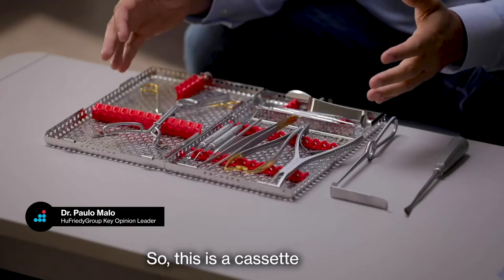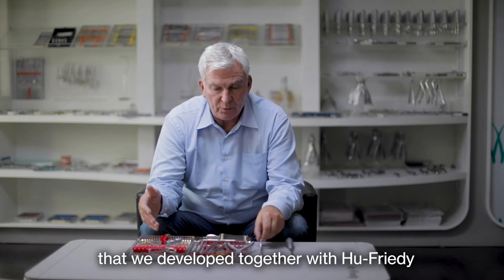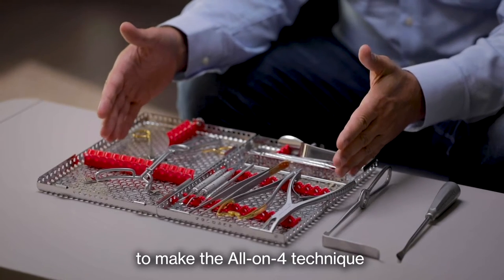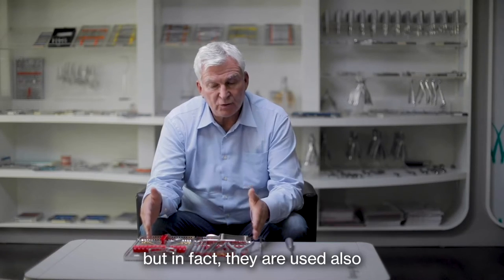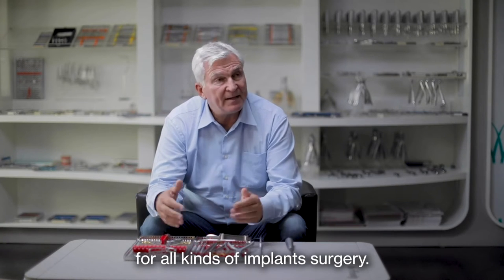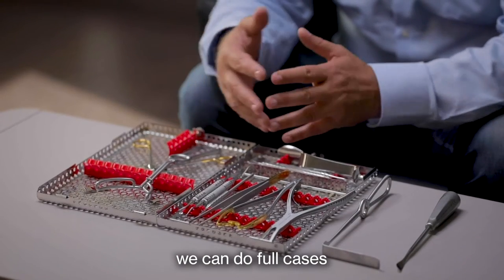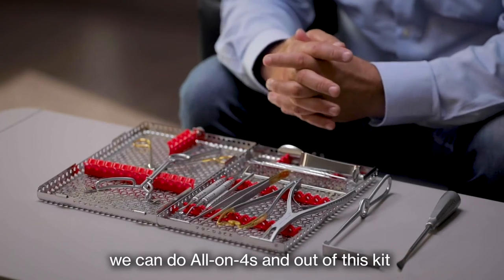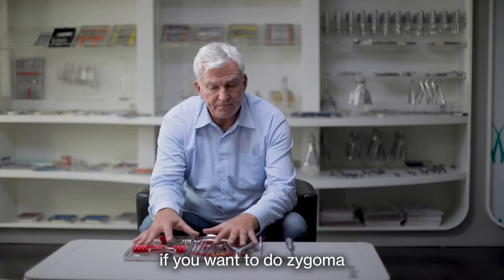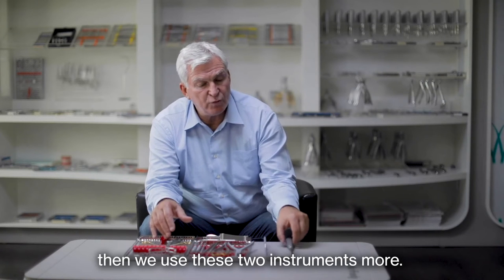This is a cassette developed together with Hu-Friedy with instruments to make the all-on-four technique, but they are used also for all kinds of implant surgery. We can do single implants, we can do full cases, we can do all-on-fours. And if we want to do zygoma — all-on-four zygoma, which we call all-on-four hybrids — then we use these two instruments more.